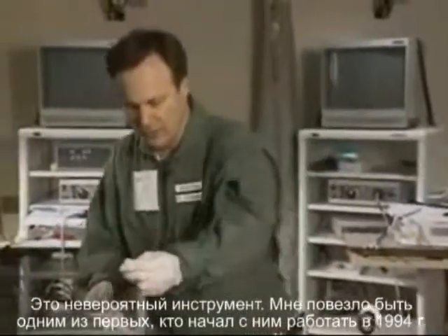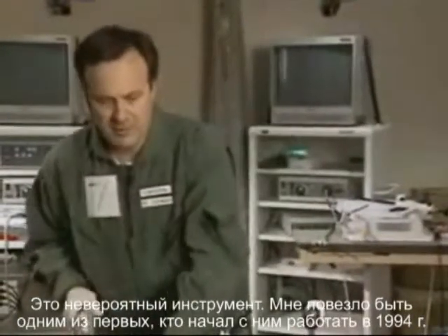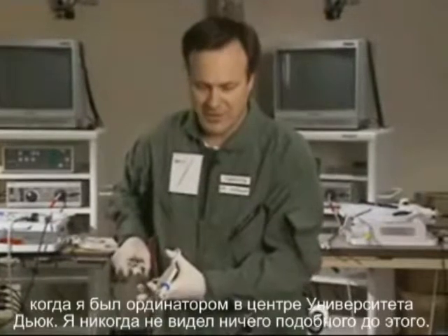This is really an incredible instrument. I was fortunate enough to be one of the first surgeons back in '94 when I was a fellow at Duke to get my hands on this. And ever since then, it's been a love affair.